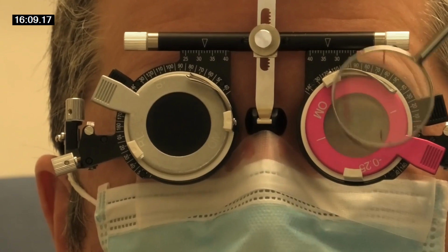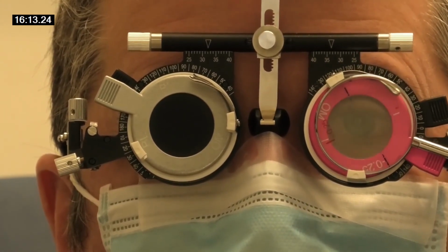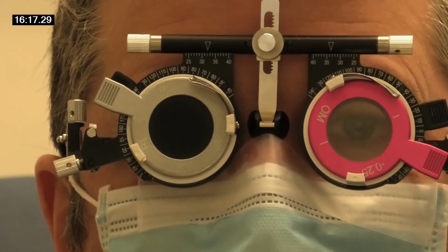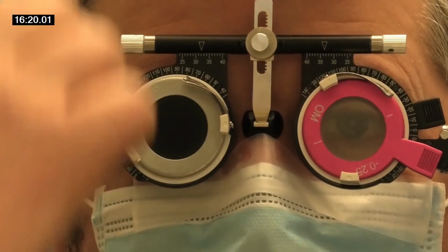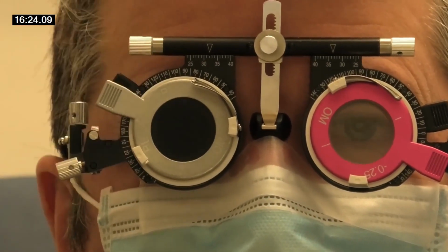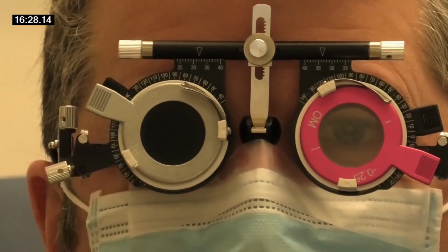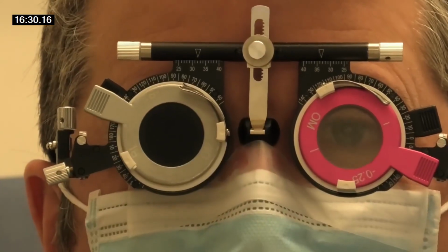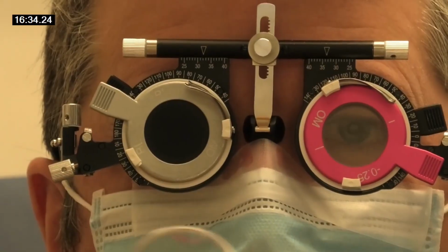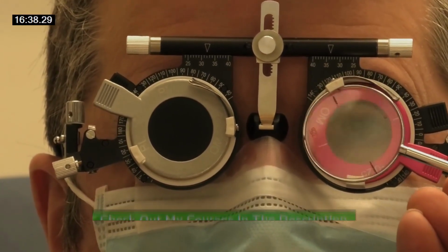Is it clearer with lens 1 or lens 2? One. Yeah. So watch when the calling is done, because you were turning it and you said 2 there. Okay. So it's hard, isn't it? It's really hard. That's hundreds of thousands of times I've done that, so I'm ahead of you. So what happened in that case? You went 1 or 2, and it hadn't even landed.